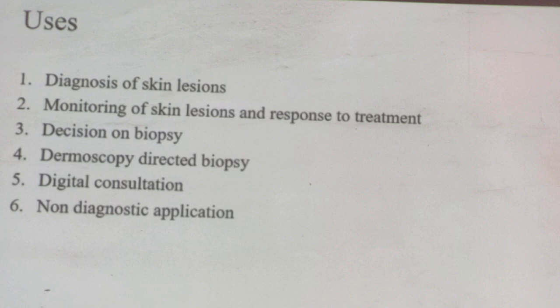Dermoscopy can be used as a tool for serial monitoring of skin lesions, thus bypassing the need for repeated biopsy. And it can also monitor the response to treatment, whether a treatment should be continued, stopped, or alternate treatment should be sought. Then it can be used to take decisions regarding biopsy. If, as explained above, while serial monitoring of skin lesions, any dermoscopic signs show any warning, it can warrant biopsy. So it can help to take a decision regarding biopsy.